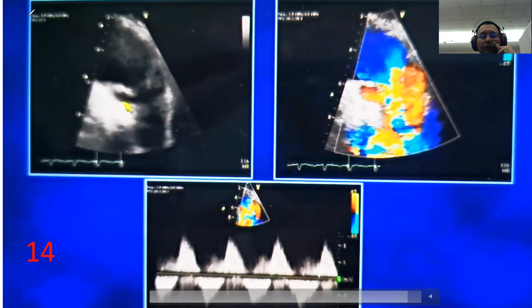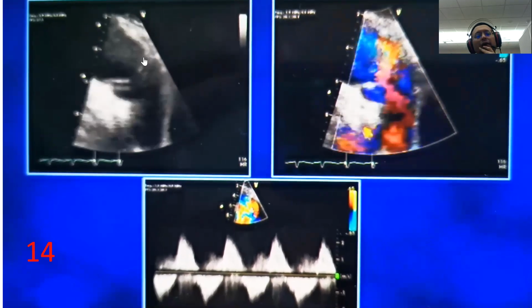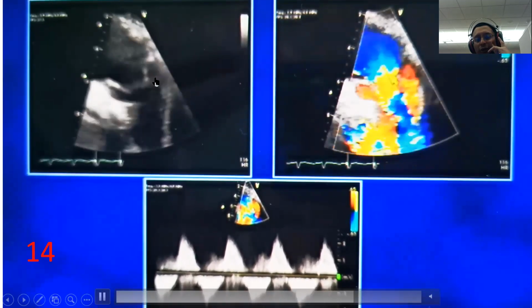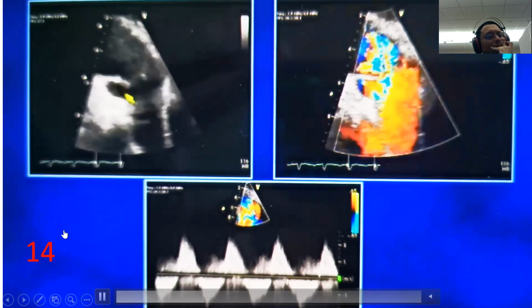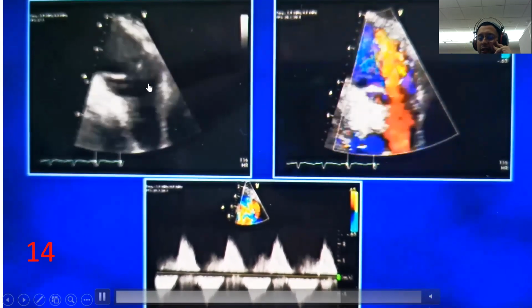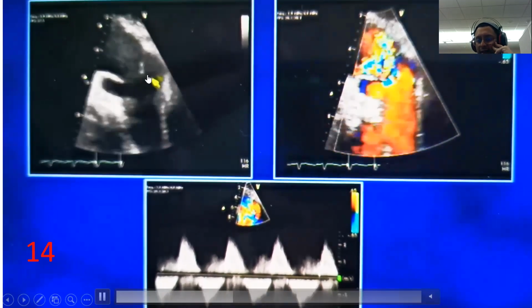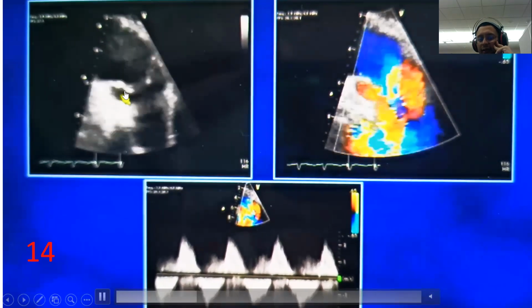What do you think is the cause of this severe pulmonary regurgitation? It's because of dilatation. Okay, possible. Look at this pulmonary valve. What does it remind you of? If you look at the leaflet tips, how do you characterize the movement of the pulmonary valve? Tethering and tenting. Okay, that's fine, but rather than tethering and tenting, this leaflet looks more like it doesn't move at all. It's retracted like Sarah said, but it doesn't move. Let's say this leaflet is retracted and doesn't move.